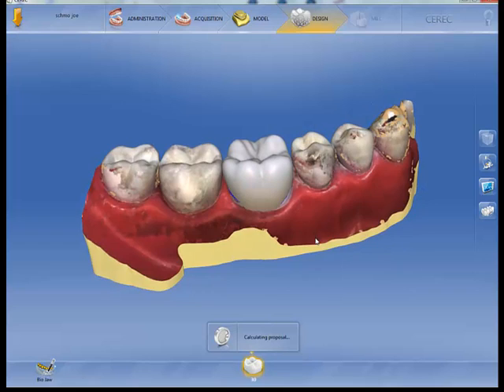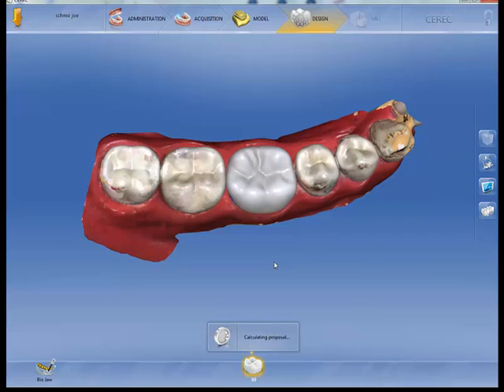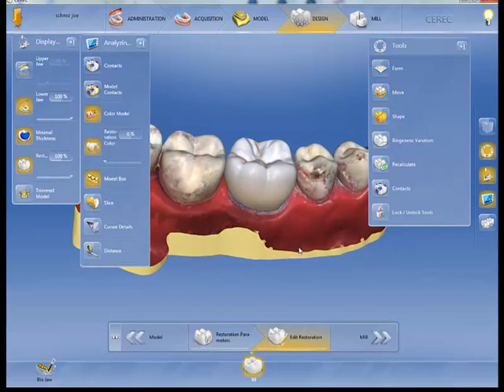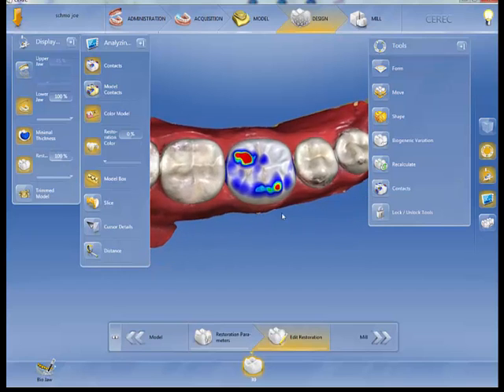It doesn't try to put it into harmony with the adjacent teeth or with the opposing arch. I told it to put it in that position and it keeps it there. If I turn the contacts on, you can see that it's in hyper occlusion — because that's where I put it.